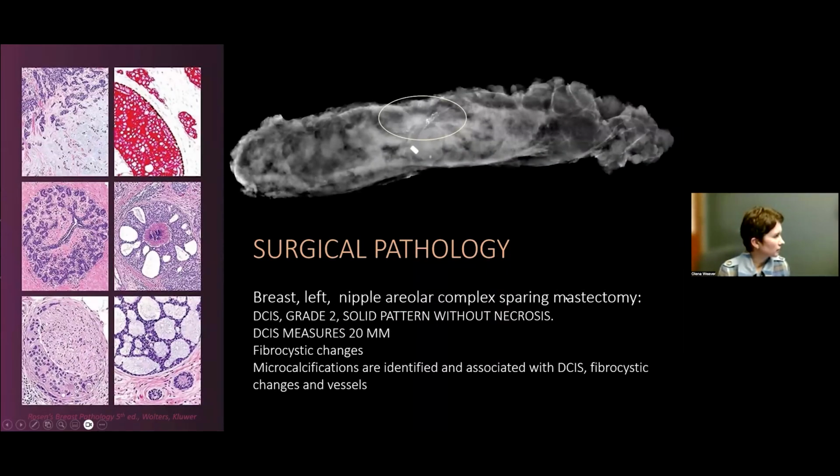After that, she actually opted for mastectomy, and it was invasive cancer plus a DCIS. The residual was a DCIS grade 2, 20 millimeters. So the CEM actually did not see the 20 millimeters of disease, right? You notice it's probably a 9 millimeter or so focal asymmetry. And it's not unusual because recombined images do not necessarily demonstrate DCIS very well. So in this case, there was a bit larger extent of disease due to DCIS.